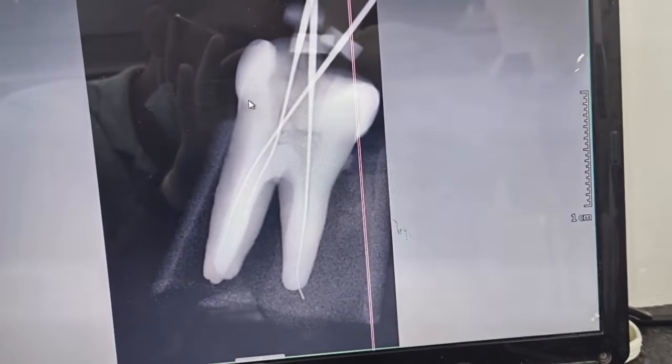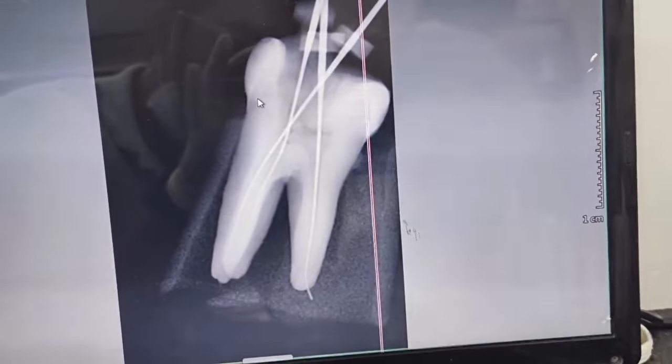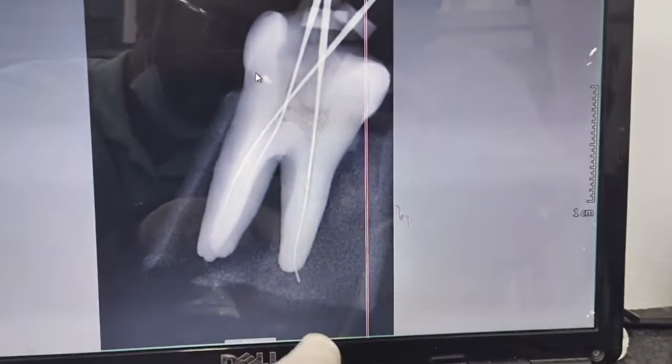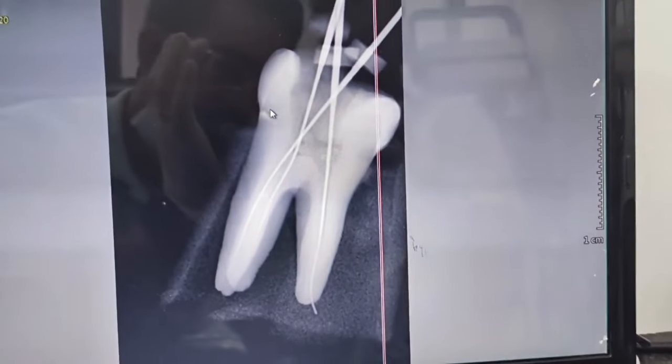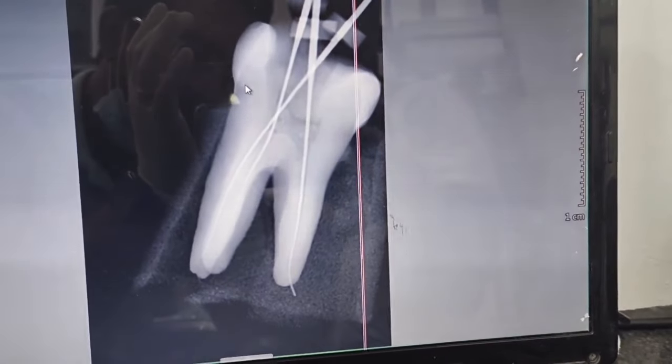So this is the x-ray of the tooth. You can see we have taken the working length, which is around 19 mm. You can see here that from the distal root, the one file is coming out. That means you need to reduce the working length. I deliberately did that so that you will be able to differentiate it.